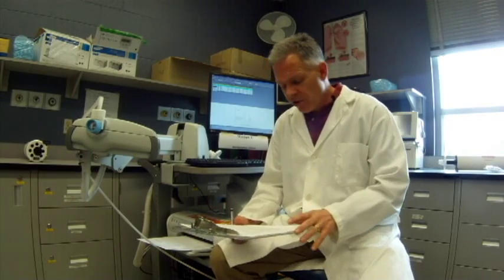Another more delicate topic is whether the patient might have problems going to the bathroom, because we are going to be physically testing them and putting them under a little physical stress. That might cause them to need to go. I always start off by asking if they need to go to the washroom now, and I let them know that with the testing they may feel the need to urinate or may have defecation problems. We can deal with that in a considerate way.